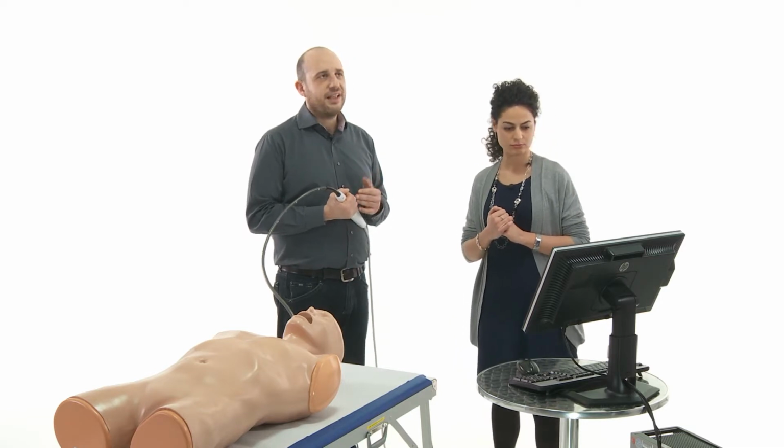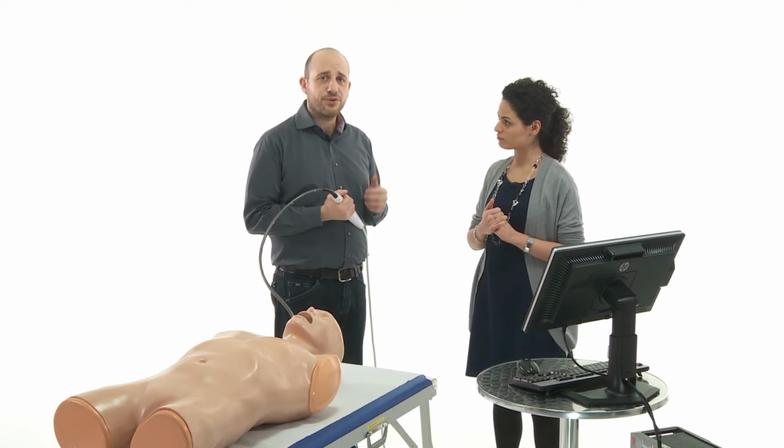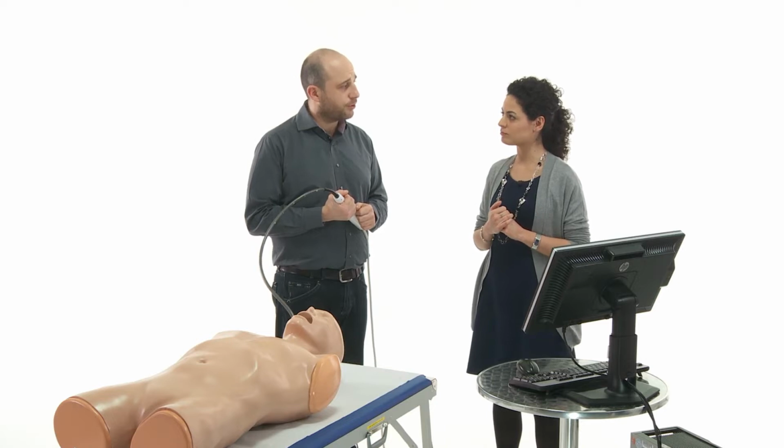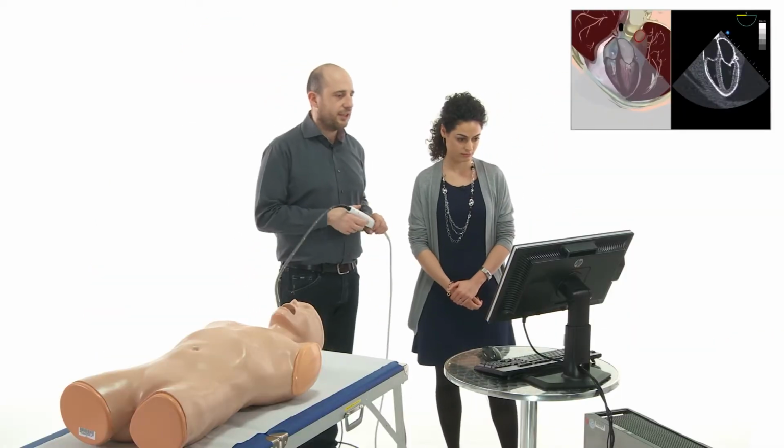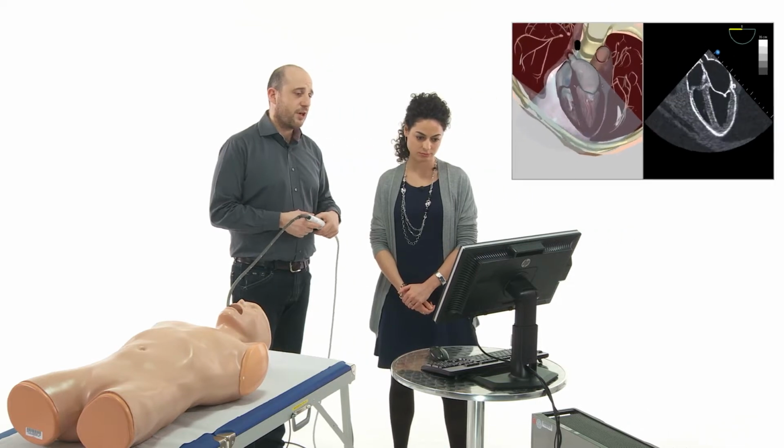We have at least 6 views to watch the aorta. We know that we have to analyze the 3 different parts of the aorta: the ascending aorta, the aortic arch, and the descending aorta. So let's go systematically and see also the anatomic correlation. Let's see the aortic views.